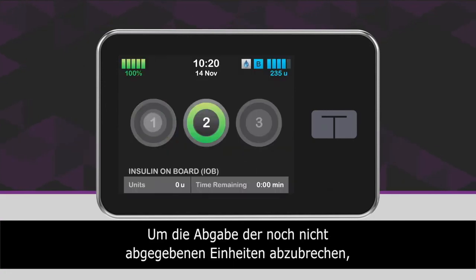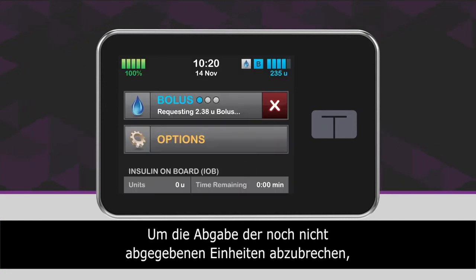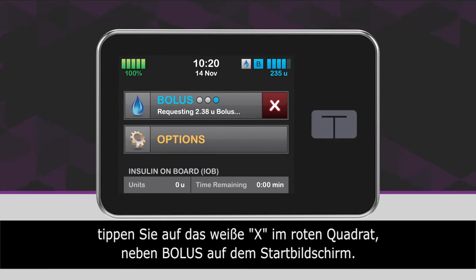To cancel the undelivered portion of the bolus, tap the white X icon in the red square next to Bolus on the home screen, then tap to confirm the canceled bolus.